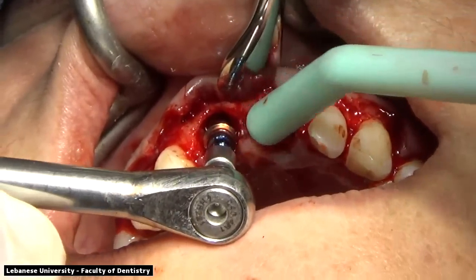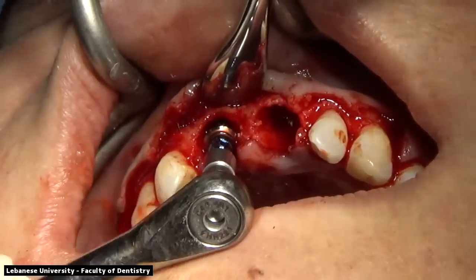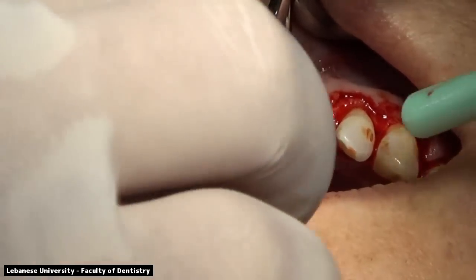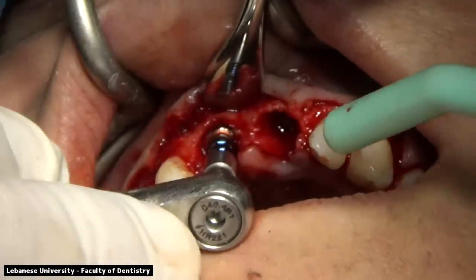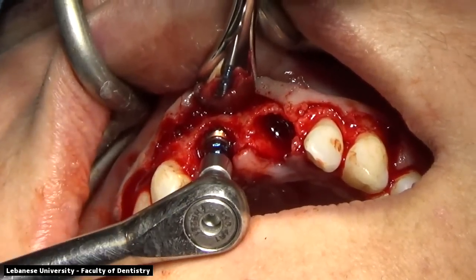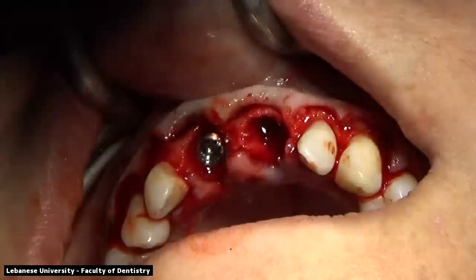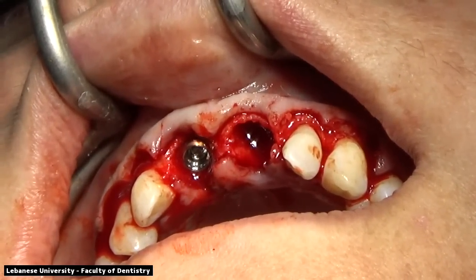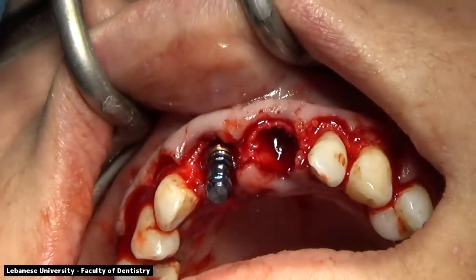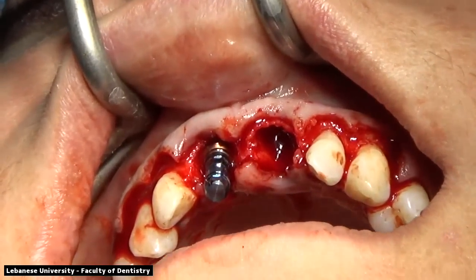You can see on the buccal aspect that the level of the implant, that is where we're going to stop. Once we stop, we stop seeing the yellow marking almost. We start seeing the blue marking at the buccal plate of bone. That is where we're going to stop. So now we are at the buccal plate of bone. We remove our torque wrench and we remove our handle. We are keeping the mount as a direction for the other implants.